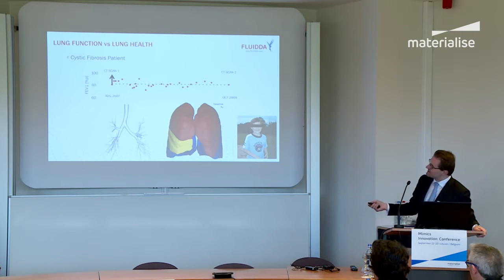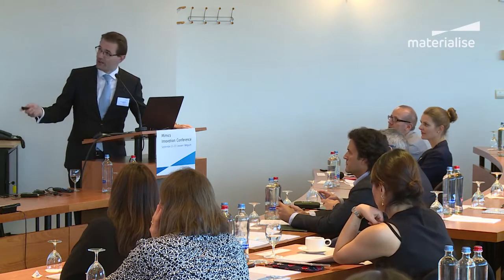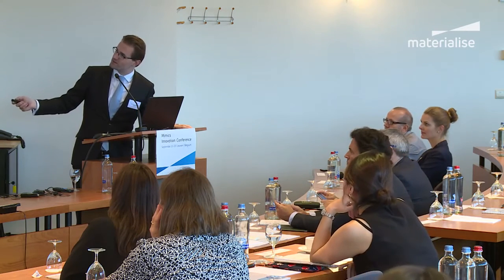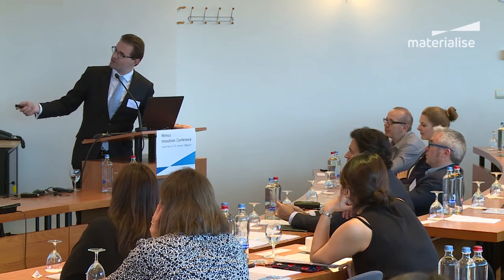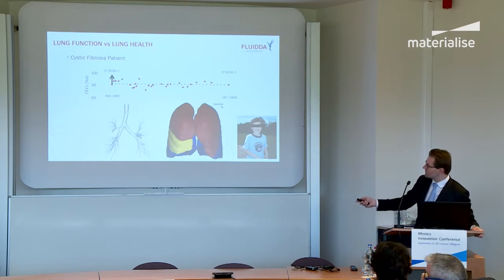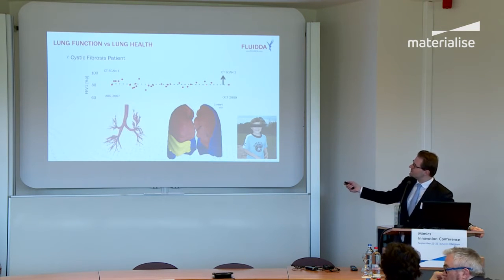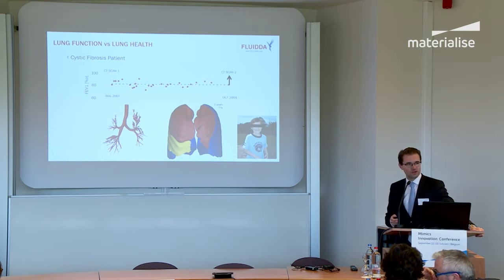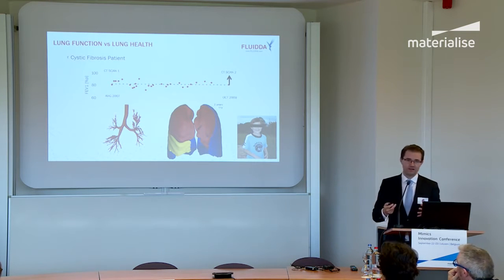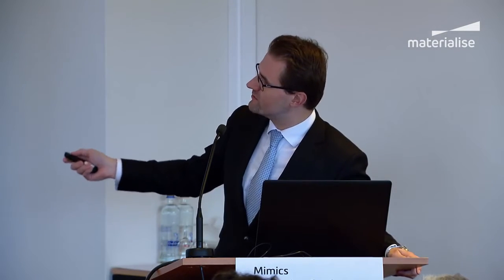But in the beginning, you actually see that the airways look relatively well preserved, and also those lung lobes appear to be quite healthy. Now, if you look at what happens over that 2-year period, you see almost a complete collapse of the left upper lobe and a significant increase in the deformations towards that lobe. So initially, everything was fine, and then you see the disease progression, which was not detected by the conventional lung function test. So apparently, the healthy areas in the lung still compensate for a progressing disease, making it undetectable by the conventional lung function test, but you already see it on the images.